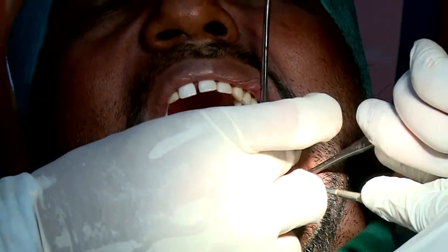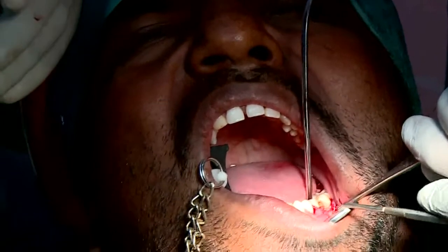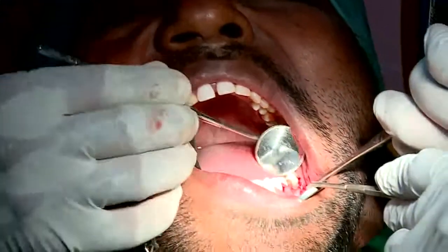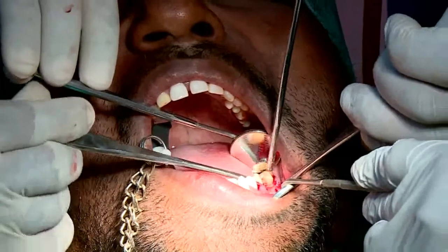Now, if I show you the picture again, you will see that the hole which was there is now covered. Am I clear? Yes, sir. I will show you the lingual margins also.